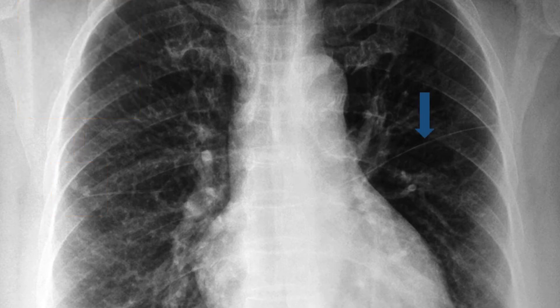The left horizontal or minor fissure is an accessory fissure found in around 8% of individuals examined with CT and 1.6% of individuals examined with chest x-ray. The left horizontal fissure separates the lingula from the rest of the left upper lobe.